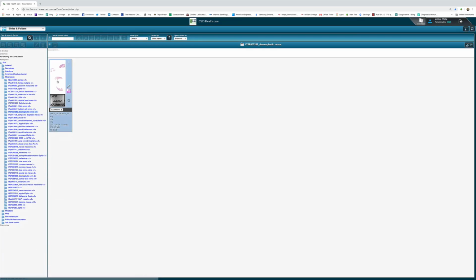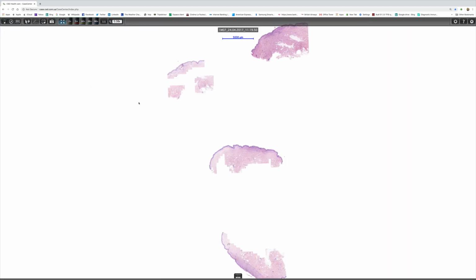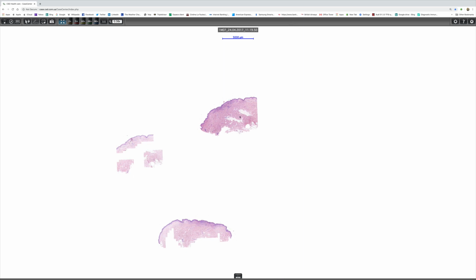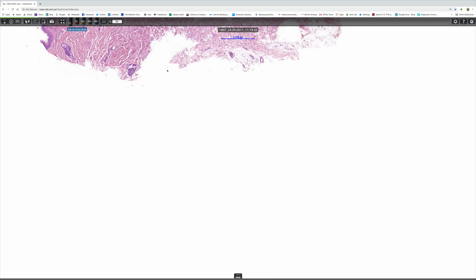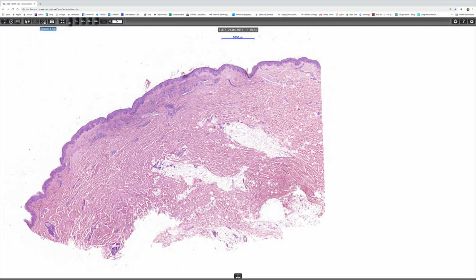We'll just have a quick squint. Maybe I'll go back to this low power. We'll just check out this top one and see if there's anything that we're missing. It's a lot better stained, which I suppose is a major plus. We'll just straighten it again.